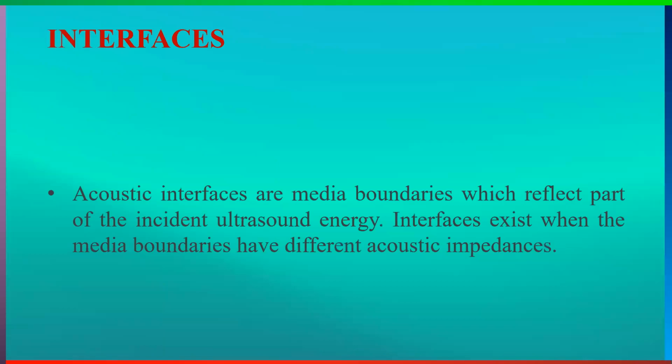So interface means media boundary. Whenever two media join with each other, the joining line of the two or more than two media is called an interface. In ultrasound, we call this interface a reflector because sound waves are reflected back from that interface. That's why we call it a reflector.